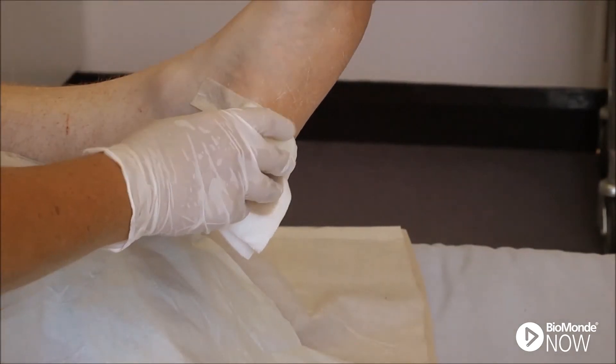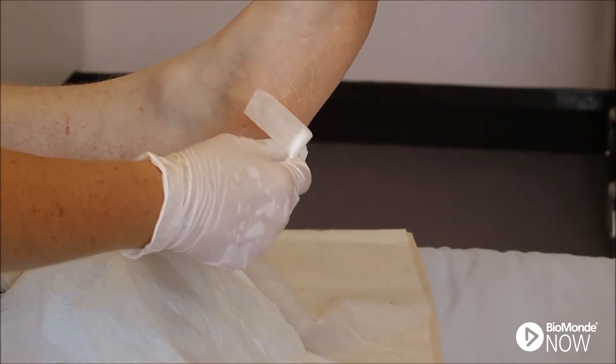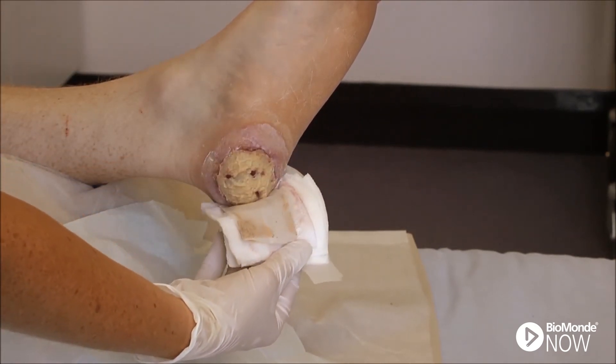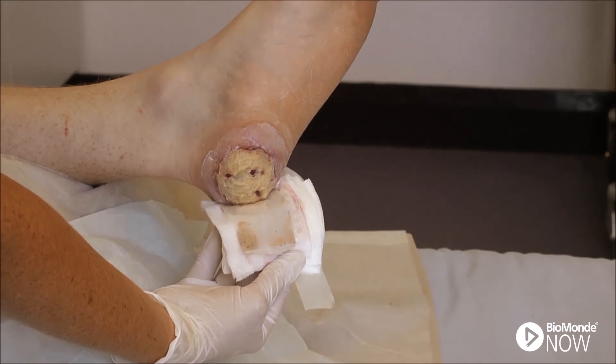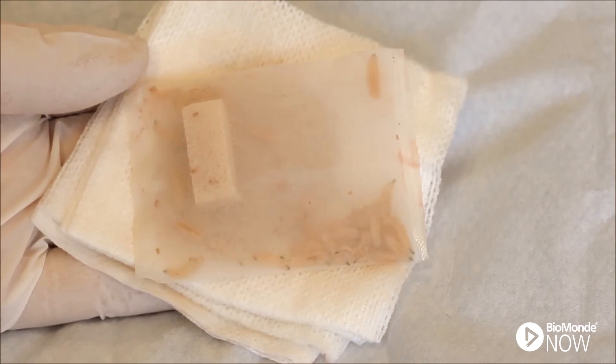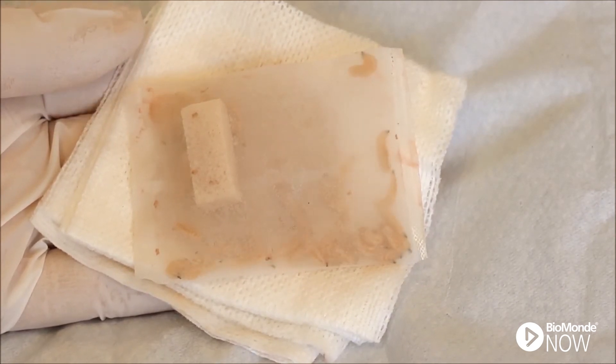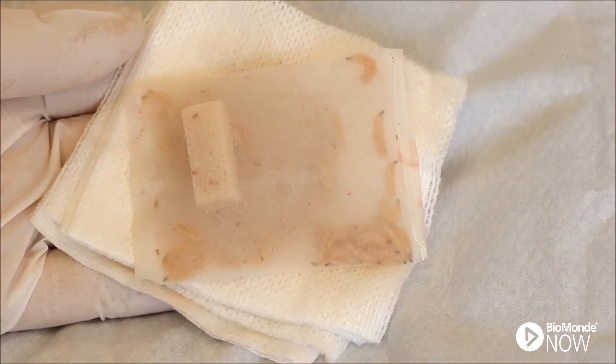Check the wound daily as outlined in the four-day care cycle. Remove the outer dressings and place the larvae onto a sterile field to allow for wound assessment. Typically there will be an increase in wound exudate which can be malodorous. Any discoloration of exudate indicates the viability of the larvae. The larvae should be moving and they should have visibly increased in size. Following assessment, replace the larvae and apply new outer dressings.